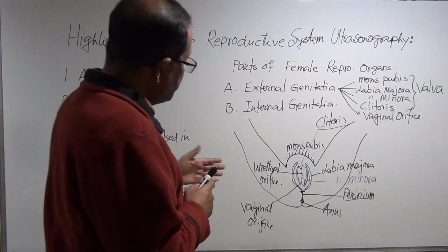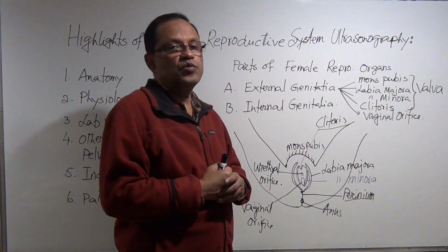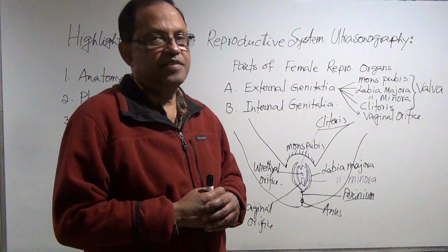So this anatomical knowledge, we have to know.